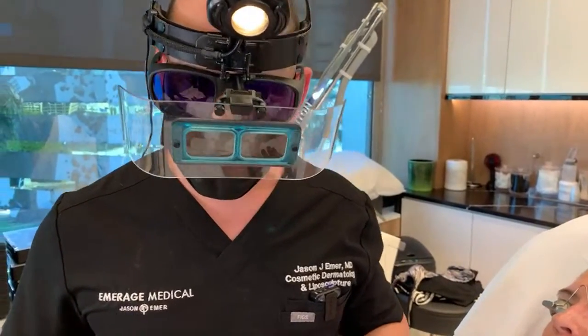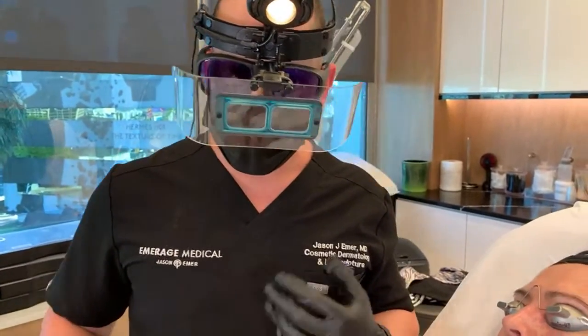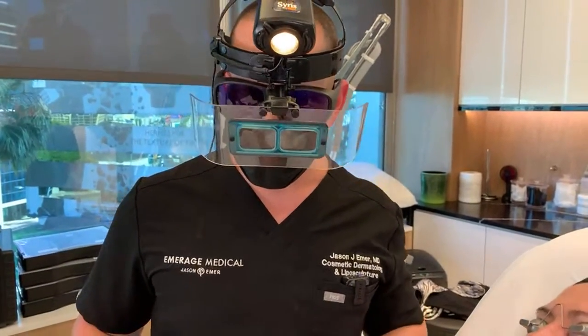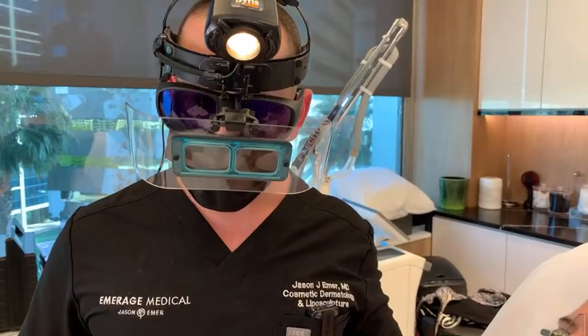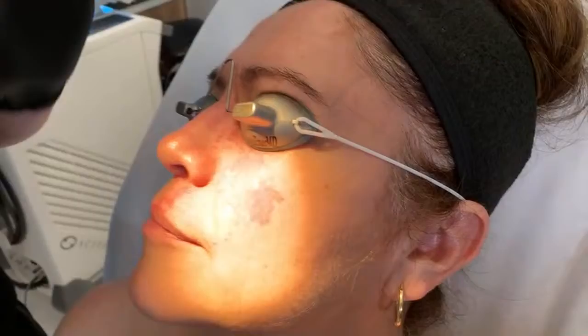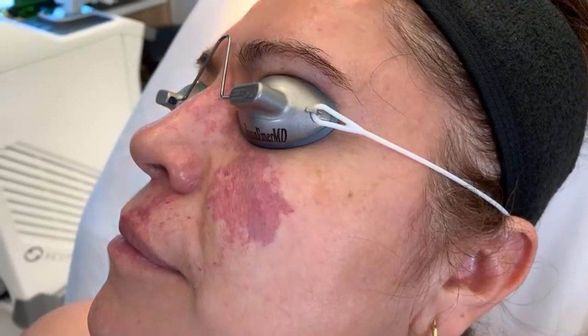Normally on surgery days we don't typically go live as many times later in the day because we're super busy. But I have a very rare birthmark that I want to show you guys called a port wine stain. This is my patient — she's beautiful — and she covers this up with makeup for a lot of her life.